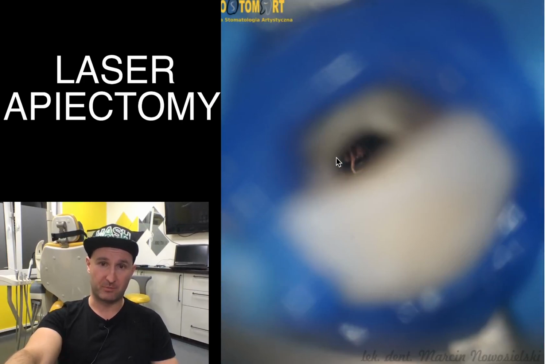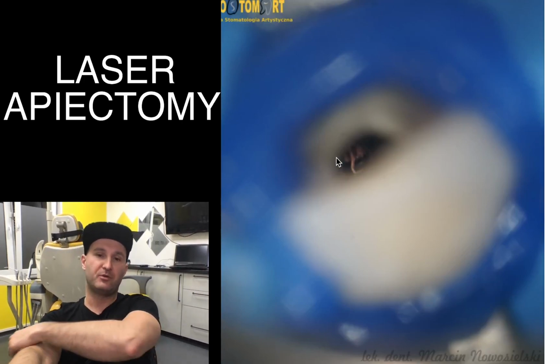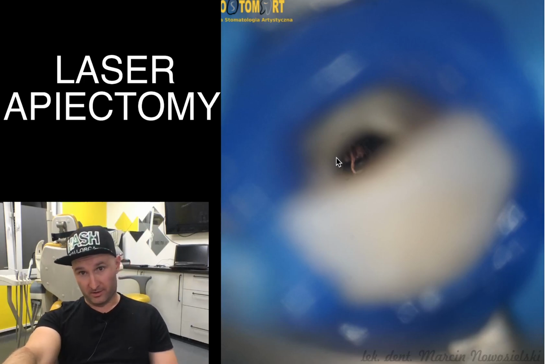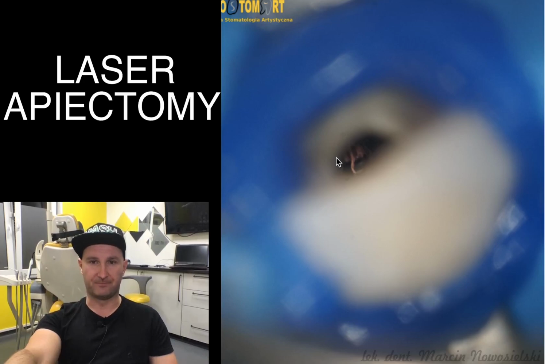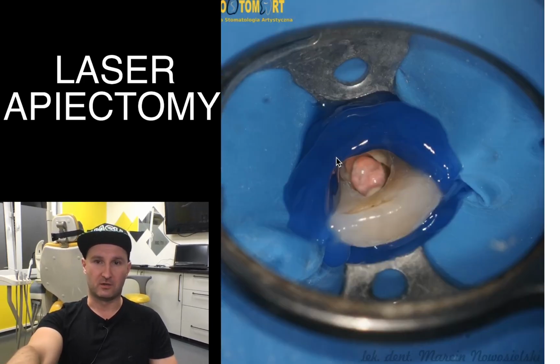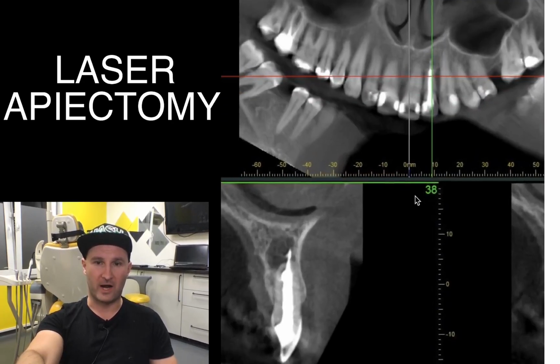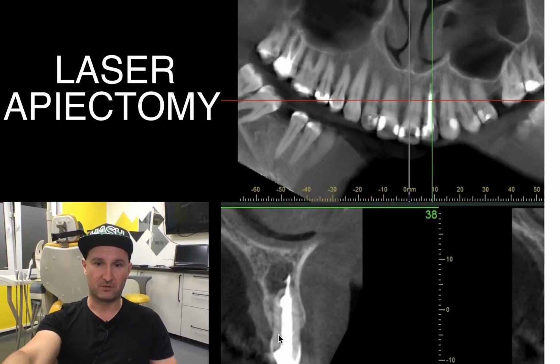After removing of gutta percha, we just re-prepared the root canal with, in this case, Reciproc R50. Actually, preparation of the canal was not so important in this case, because the root canal was already very wide prepared, as you can see.